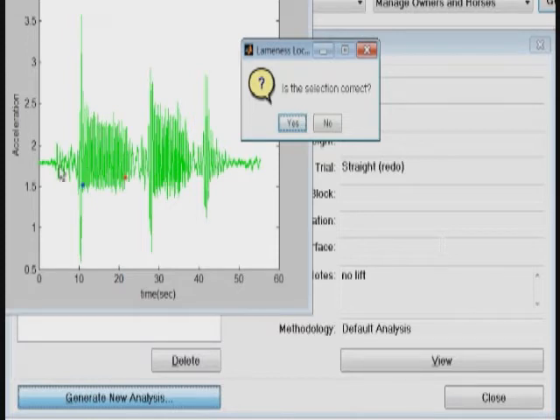In this particular example, the horse was at first standing still, as shown by small vertical head movement at the beginning. The horse then trotted off in one direction, and a large and regular vertical head motion is seen. The horse then reached the end of the lameness evaluation area and turned around. When turning around, the vertical head movement is reduced. The horse then trotted back in the opposite direction, and regular vertical head movement increased again.